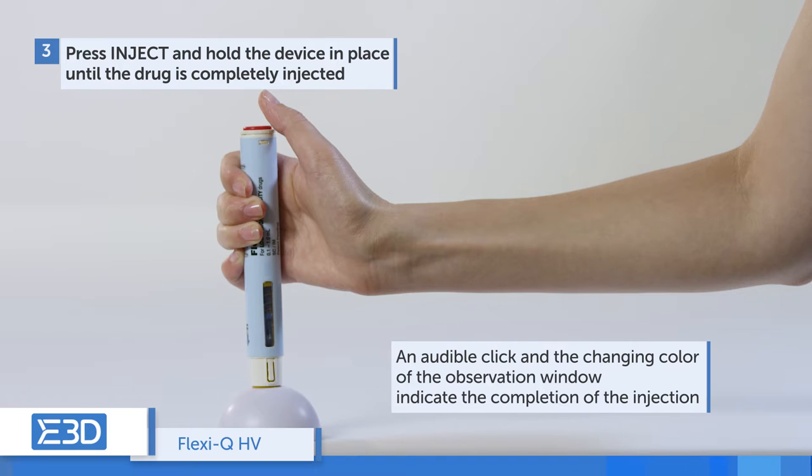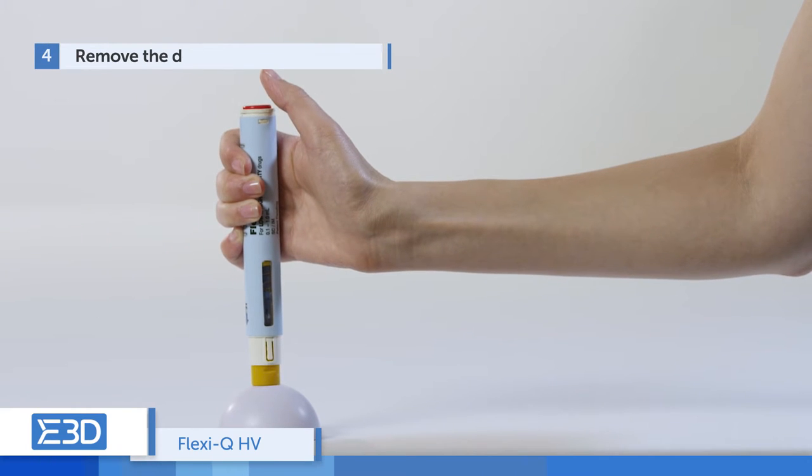An audible click and the changing color of the observation window indicates that the injection is completed. Remove the device from the skin.